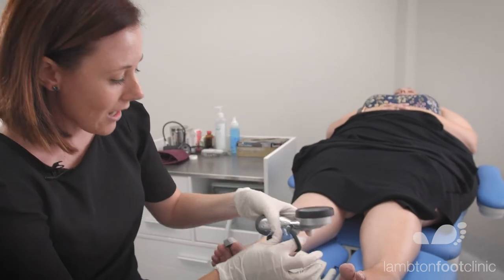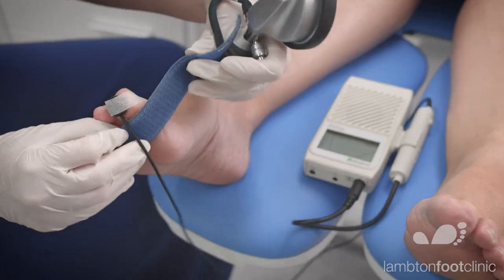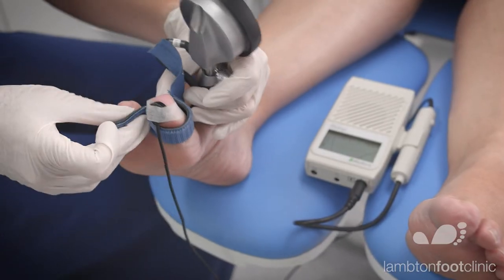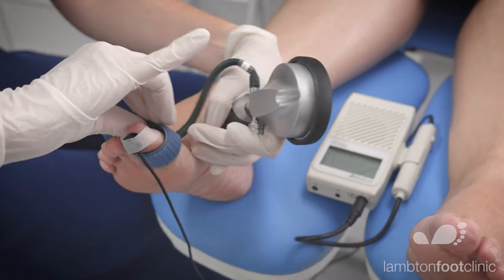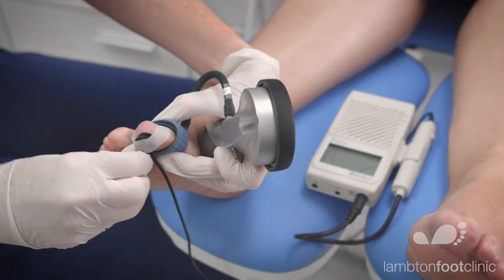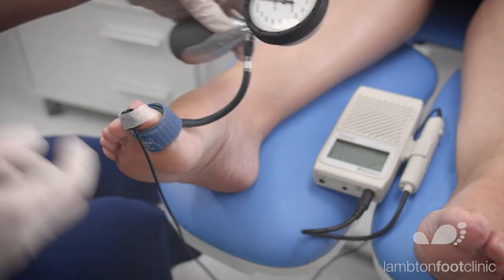Place my toe cuff. So the toe cuff just sits down on the base. Needs to be fairly firmly placed and proximal to where the PPG probe will sit.